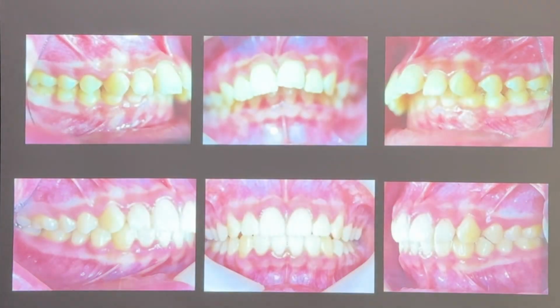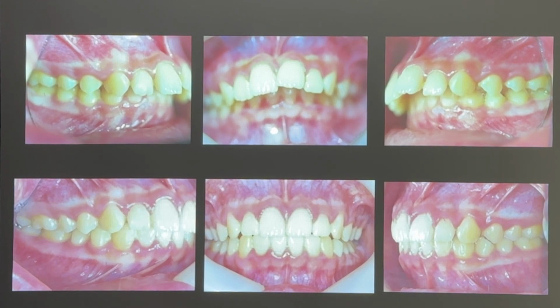So thrust the patient's tongue, child sitting here. Please thrust your tongue a little bit, okay? And then this is a mirror or tongue blade.